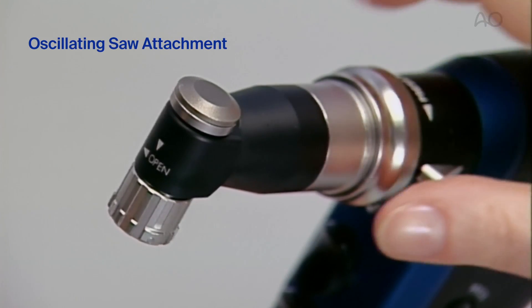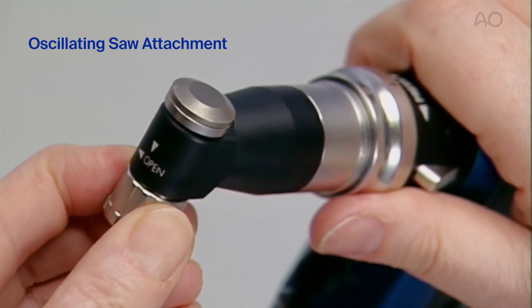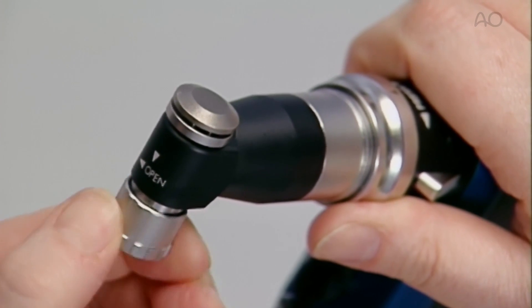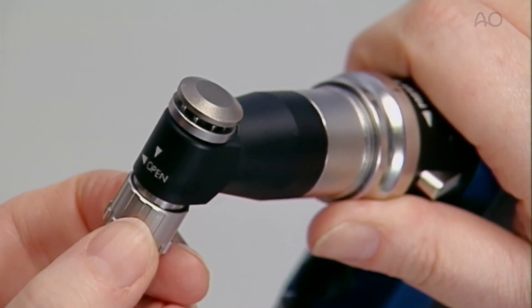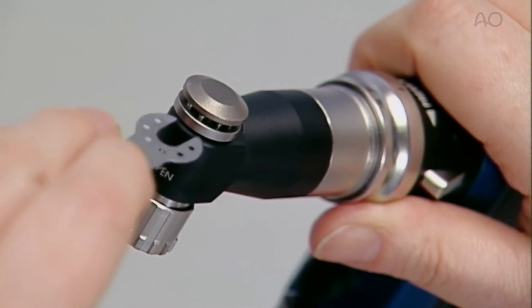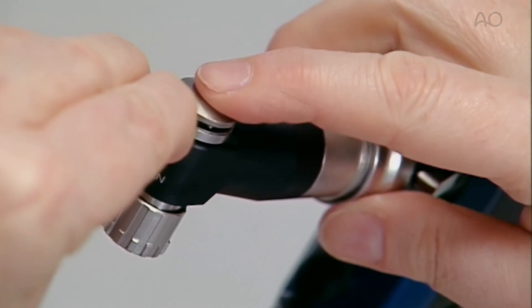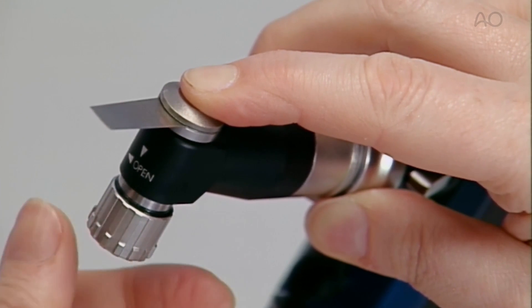To mount a saw blade in the oscillating saw attachment, the locking button is pulled down and rotated until the coupling is open. The blade is inserted in the required position, the coupling is pressed down, and the locking button is tightened.